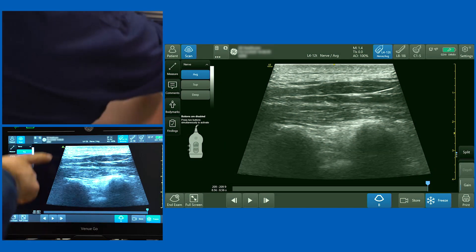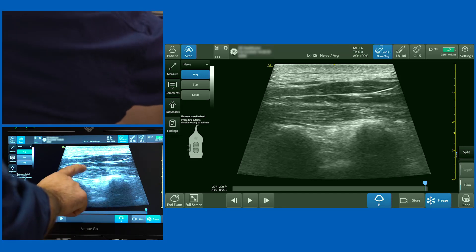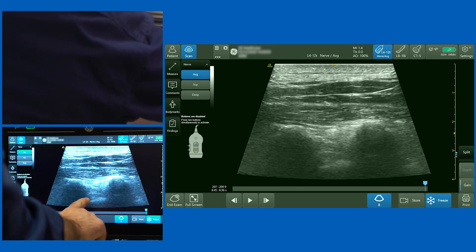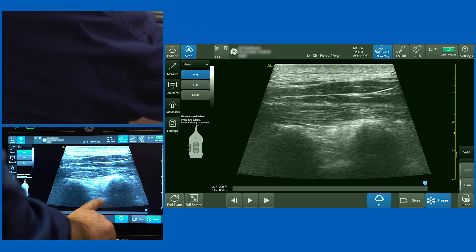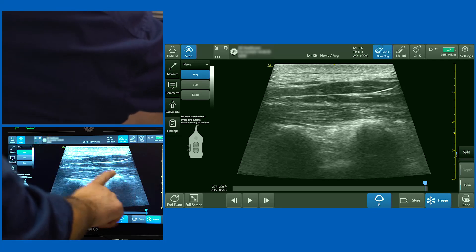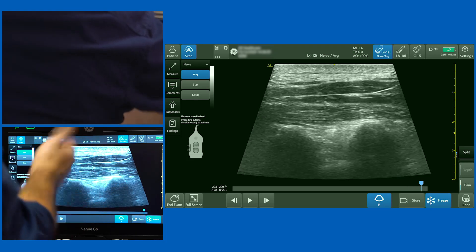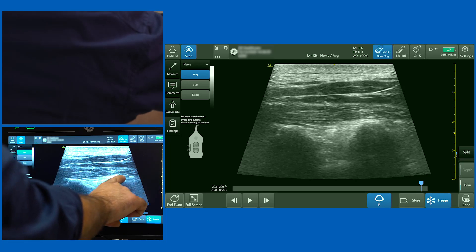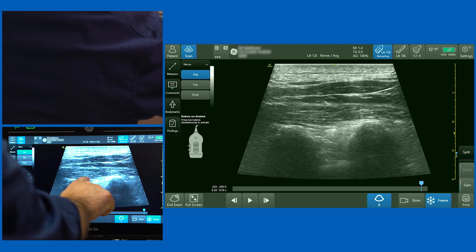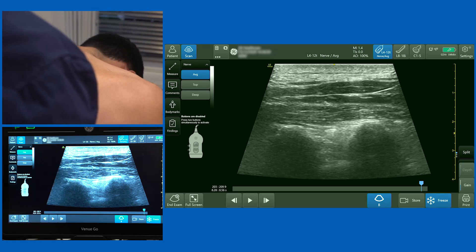Looking at the image on the screen: you've got adipose, the trapezius, a very thin rhomboid, and then the erector spinae muscle deep to it. You've got one transverse process, another transverse process, and the pleura just visible. Bringing your needle in from either direction, the idea is to lift the fascia up off the transverse processes. Aiming for one side of the transverse process or the other, as you inject local anaesthetic you get a very classical black stripe appearing on the screen, lifting that muscle off the transverse processes.